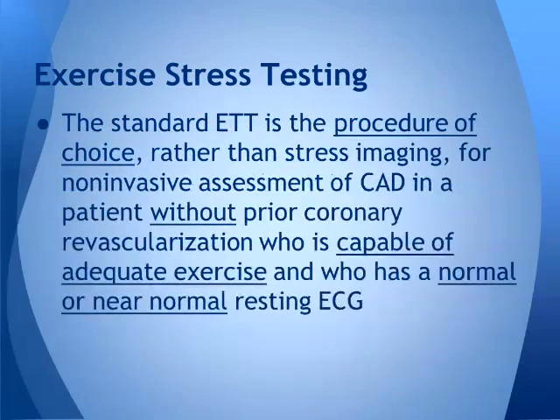So the standard exercise treadmill test is the procedure of choice rather than stress imaging for non-invasive assessment of coronary disease in a patient without prior coronary revascularization who is capable of adequate exercise and who has a normal or near normal resting EKG. So there's a lot of ifs, ands, or buts in there, right? They've got to be without prior coronary revascularization, and they've got to be able to exercise, and they've got to have a normal or near normal EKG. And if they meet those criteria, an exercise treadmill test without imaging is the test of choice in these patients.